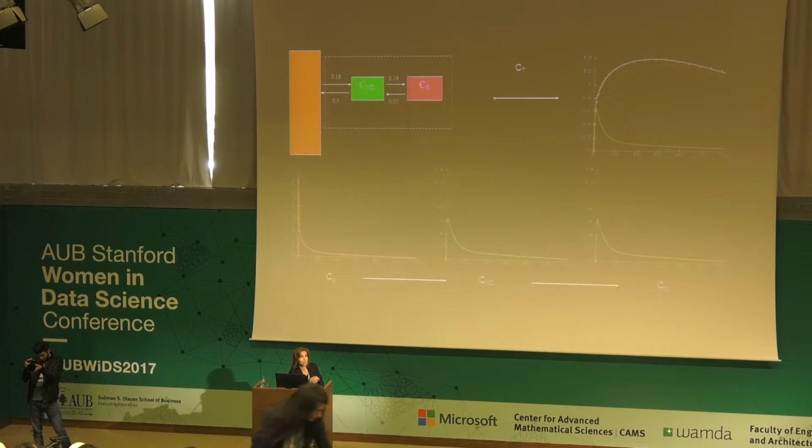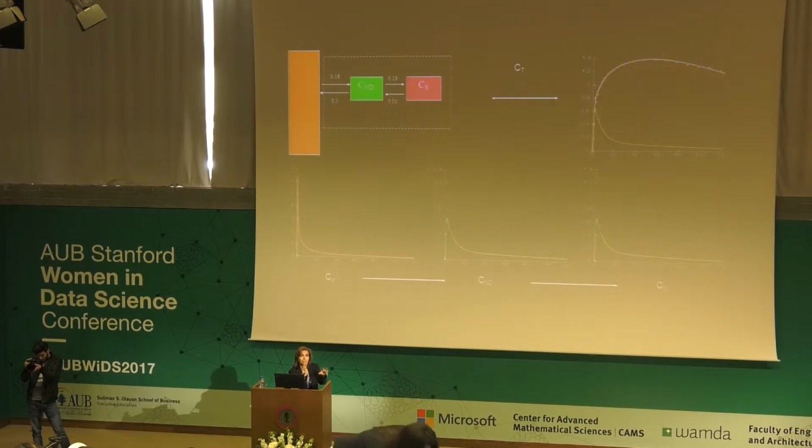So we assume different compartments. These are spaces where the radioactivity is well stirred at all times, so they're homogeneous. There are 3 compartments, for example, for analysis of receptor data. The plasma is one compartment, and from there, the radiotracer is going into the brain where there are 2 compartments, specific and non-specific. What are the differences between specific and non-specific?